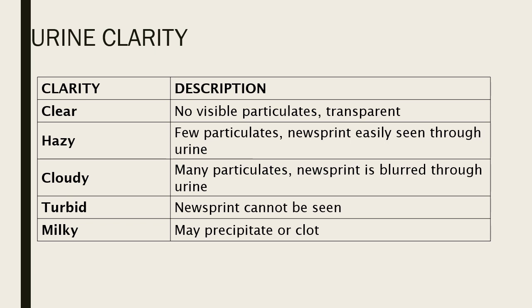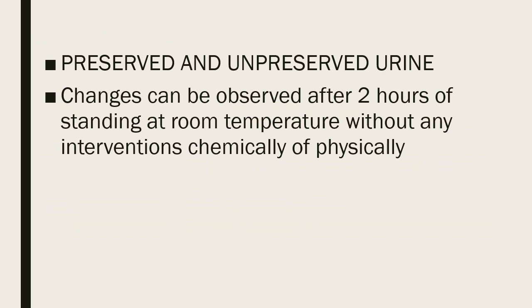That is for your urine clarity again: clear, hazy, cloudy, turbid, and milky. Please know this by heart. Changes accordingly can be observed after 2 hours of standing at room temperature without any interventions, chemically or physically.